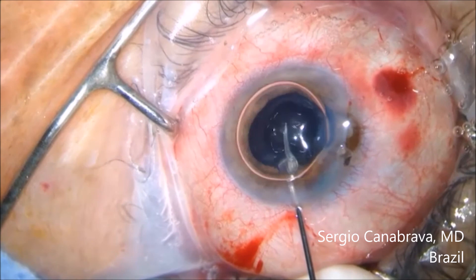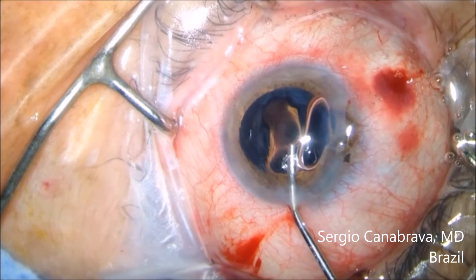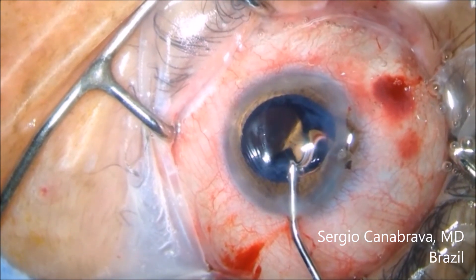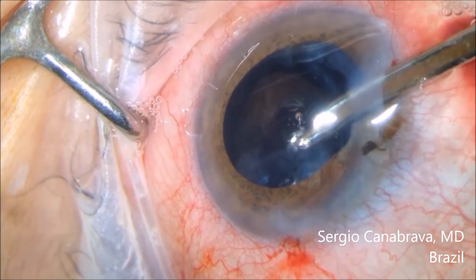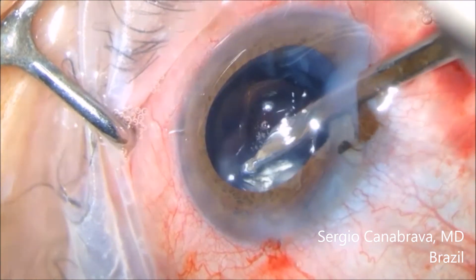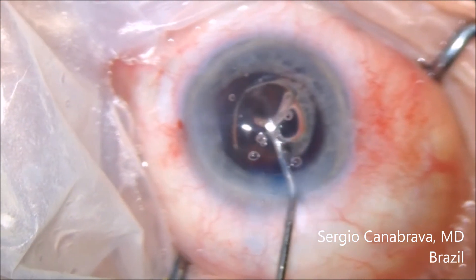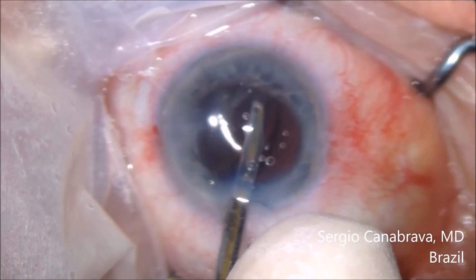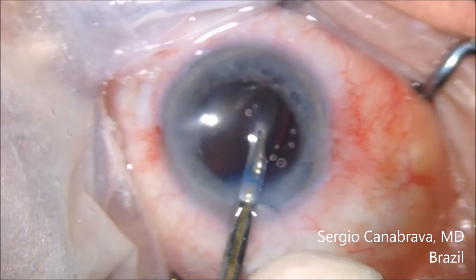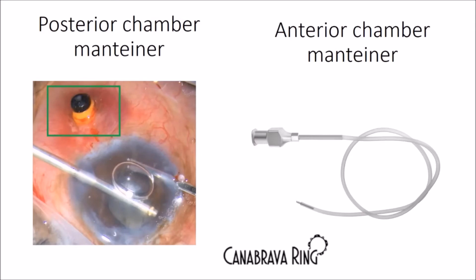I have two ways to manage this. Number one: the vitreous bubble technique — I reported this new technique two years ago. You inject an air bubble into the anterior chamber and use OVD to push the air bubble to the posterior chamber. This bubble works like a barrier and allows you to aspirate the cortex, as seen in these two videos.